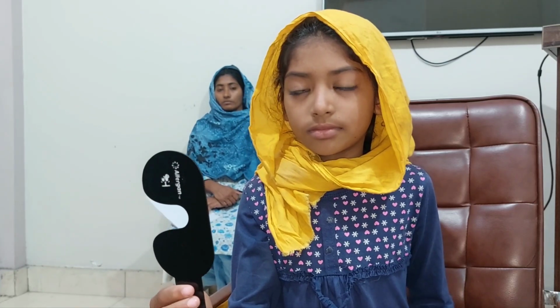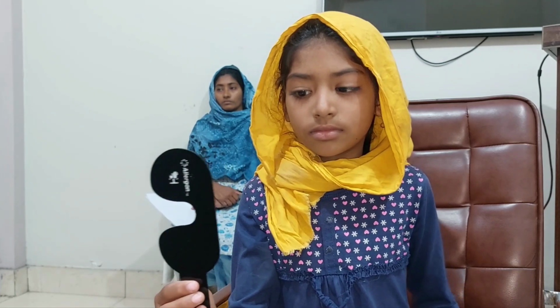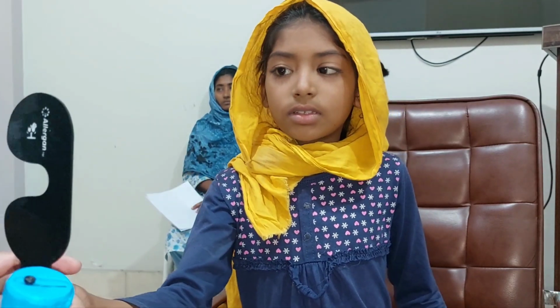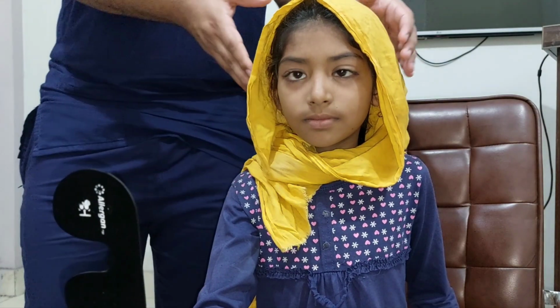So we want to examine the squint or measure the squint in the primary position. So again ask the patient to keep the head straight, or you can ask some assistant to keep the head by firmly grasping it. Please come, hold the head so that the head stays straight.